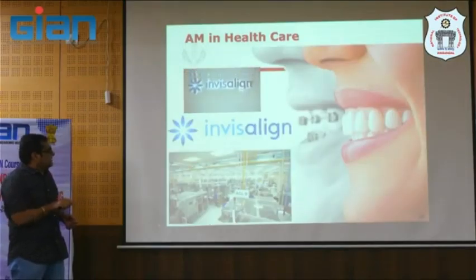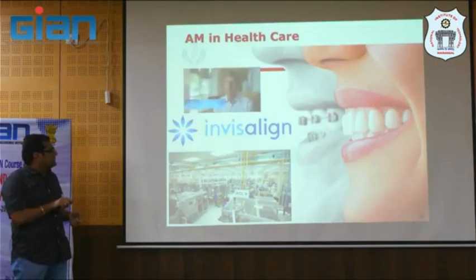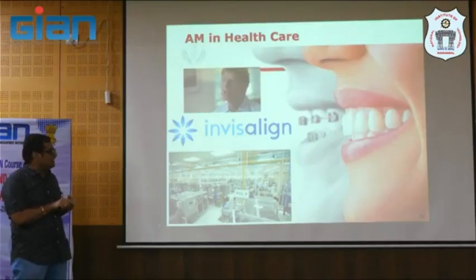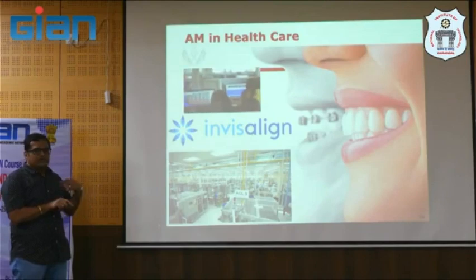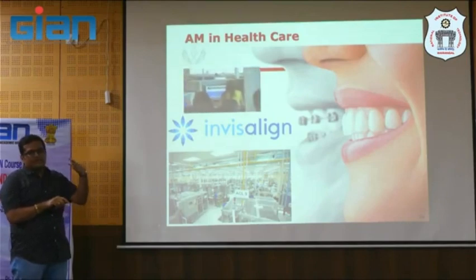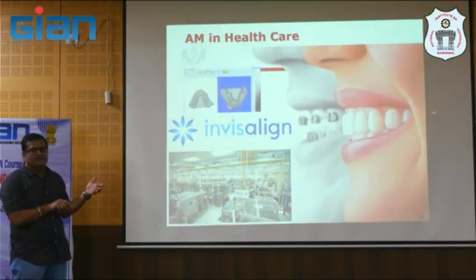And try to see this kind of teeth aligner. The early versions of these teeth aligners were normally a kind of clip or wire, and they looked very ugly. But now you can see an LCD based or VAT based system, where you can print in 100% transparent material. Hardly can you notice whether he or she wears a teeth aligner like this.